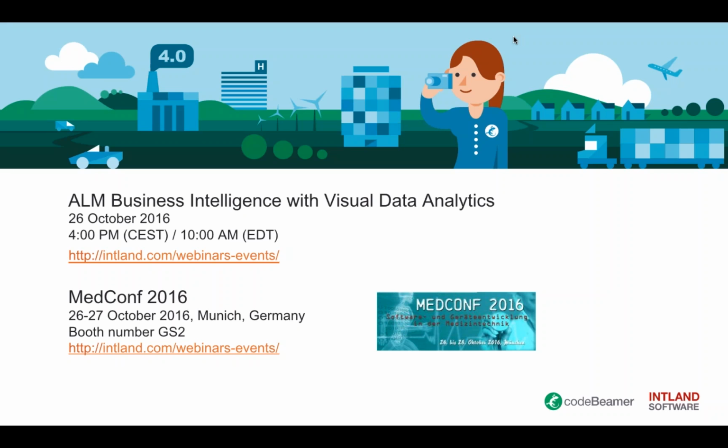So I would not do an own project for each software unit, but you can do it all in the same project, setting the traceability links according to your needs. You can simply use the software units. In my current project, I have about 15 software units in the same project in one software system.